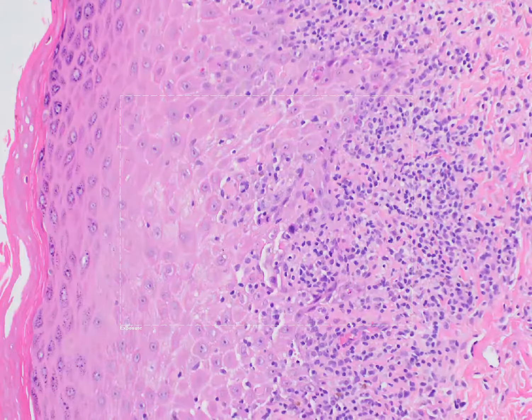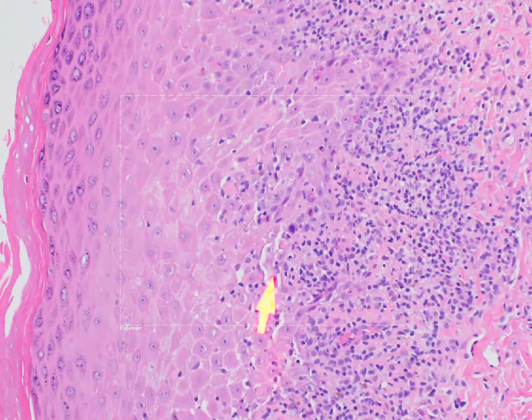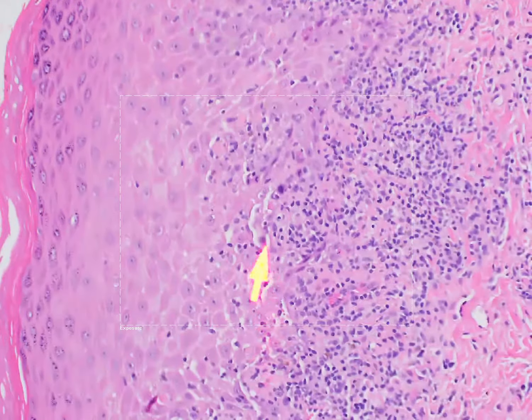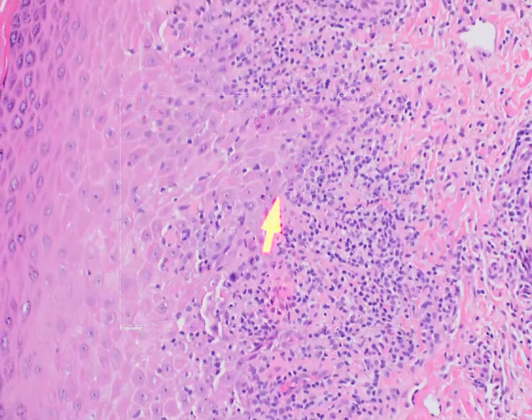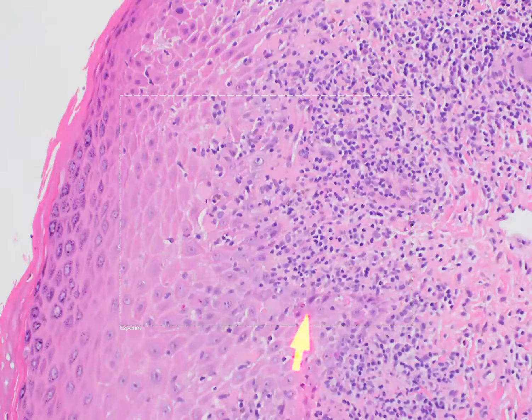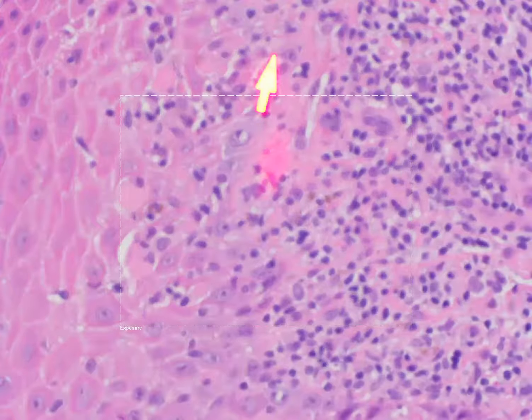There is basal vacuolization of the epidermis. So the basal epidermis shows white spaces around the keratinocytes, which represents vacuoles forming as a result of this lichenoid interface infiltrate. Concomitant with that, we can appreciate bottom-heavy cytoid bodies.